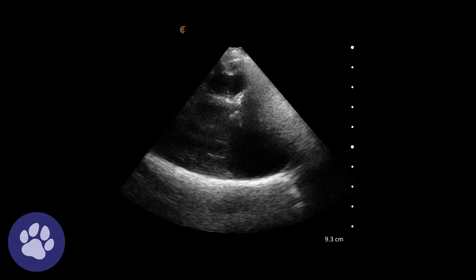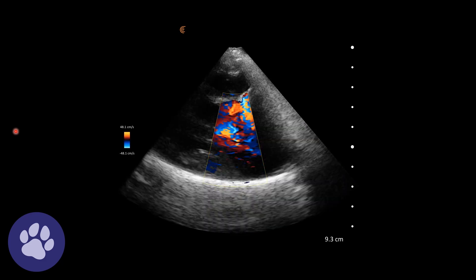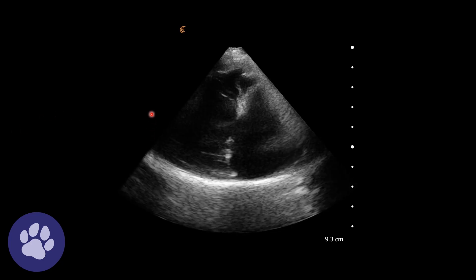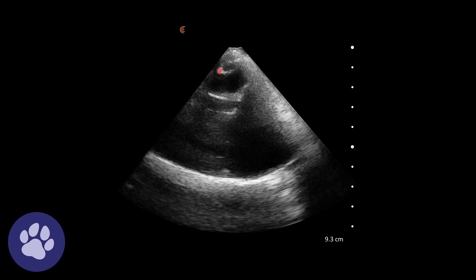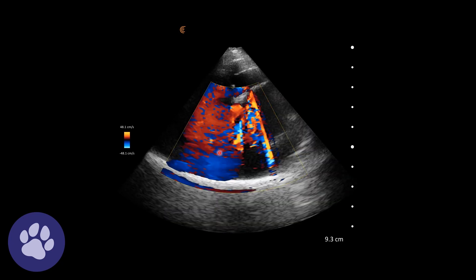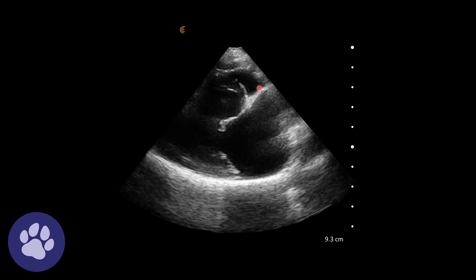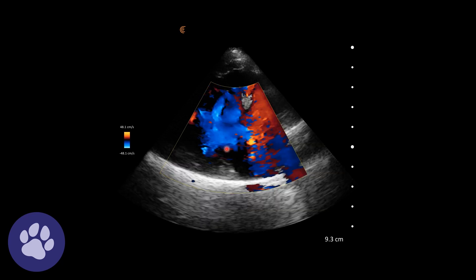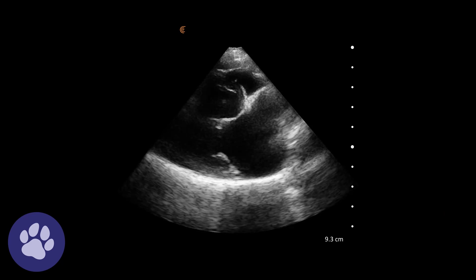Here we have our right-sided views of the heart — this is our right parasternal long axis four chamber view. We've got the left ventricle here, the mitral valves here, left atrium here and the right side of the heart up here. The first thing we notice is that the left atrium is quite large, quite a bit larger in width than the left ventricle. We're looking for some regurgitation or evidence of that over the mitral valve, though it's not so easy to see at this angle.